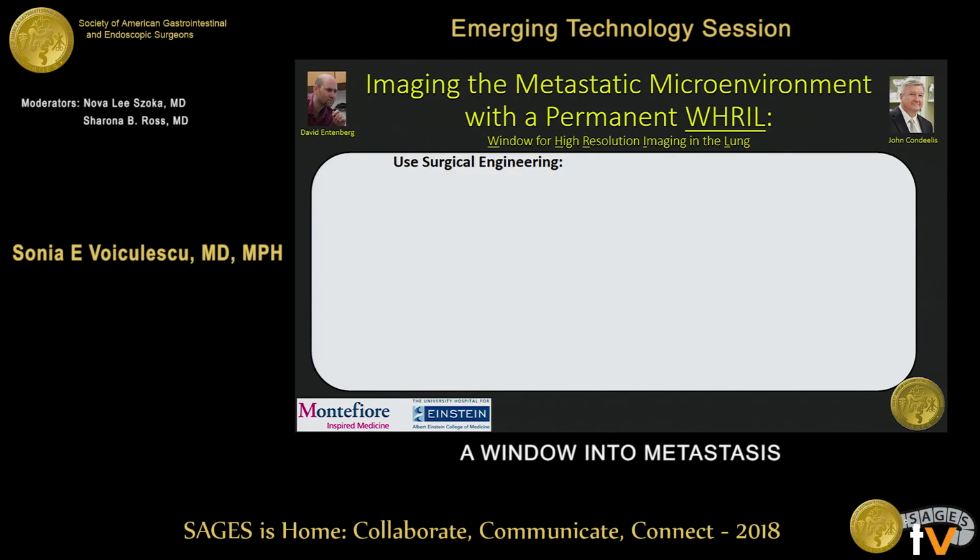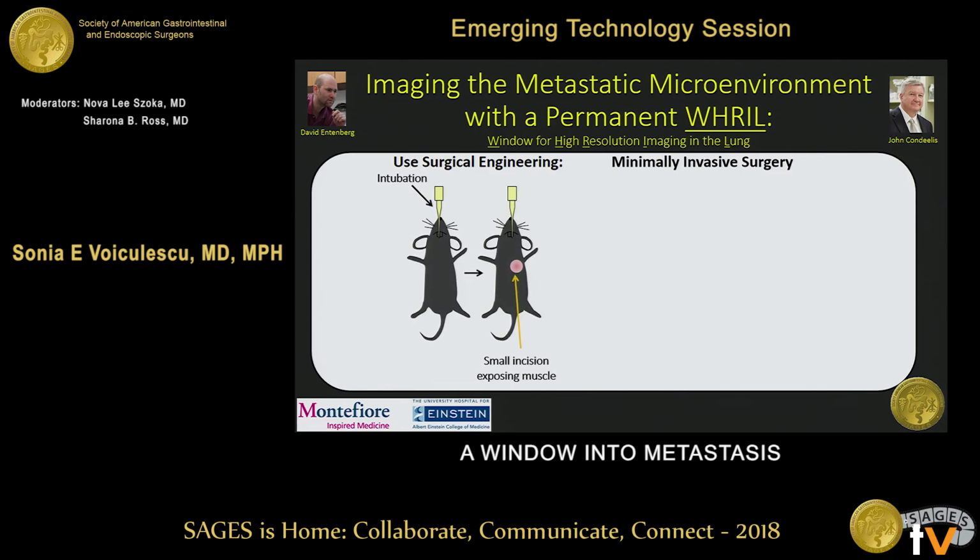So what this fellowship was able to do is bring surgery out into the bedside, and we paired up with the physicist, and this is Dr. Candelas, my mentor, and we were able to create a minimally invasive surgery and create this permanent window for high-resolution imaging called the Whirl. So in short, we intubated the mouse. We made a much smaller incision, exposing all the way down to the lung, small enough just to fit this stainless steel window frame, about 8 millimeters in diameter.